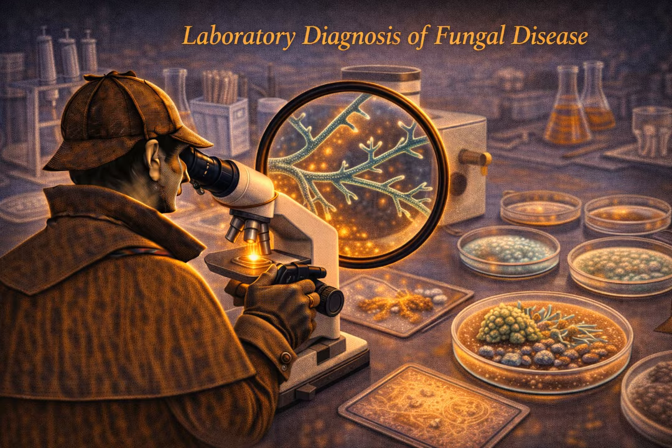Number 2, histoplasma antigen. This one is best detected in urine, though you can do serum too. Urine. Why urine for a respiratory or systemic fungus? Because the histoplasma circulating galactomannan antigen is a relatively small molecule, and it gets filtered and highly concentrated by the kidneys. In a patient with severe disseminated histoplasmosis, like an AIDS patient where the fungus is spread everywhere, the urine antigen is extremely sensitive. It's vastly faster than waiting 12 weeks for that bone marrow culture to finally grow.